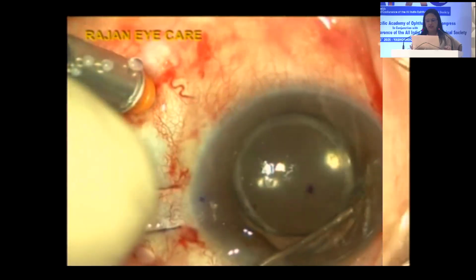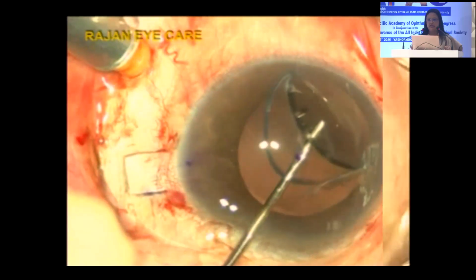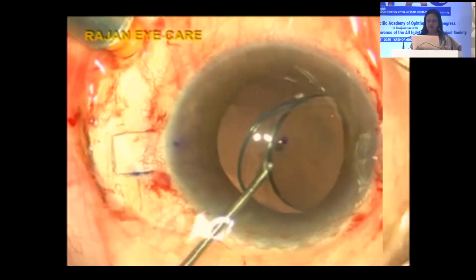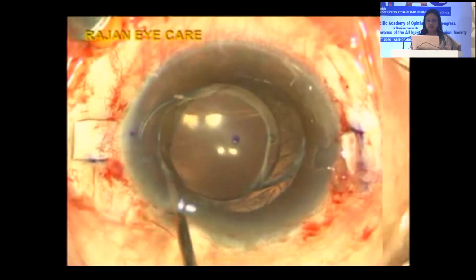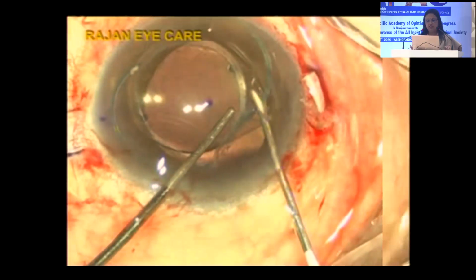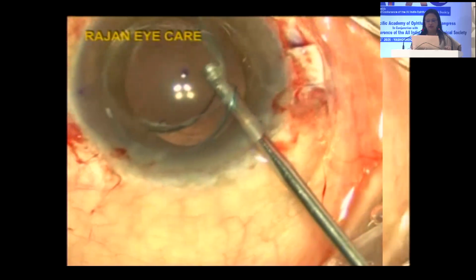Now what I'm doing is I'm lifting the lens out of its position. You can see how easily it is coming out. Absolutely, there are no zonules. But it's very important that it doesn't fall into the vitreous. So you have to very carefully place it on top of the iris. I'm trying to remove the capsule, but it's not possible. So I'm going to use a vitrector to remove the posterior aspect of the capsule.